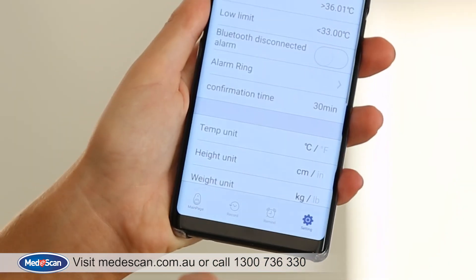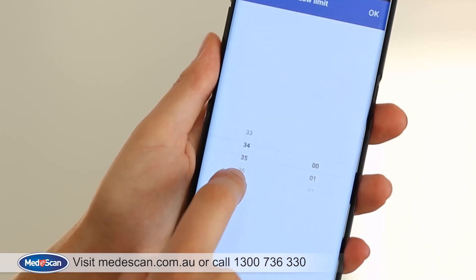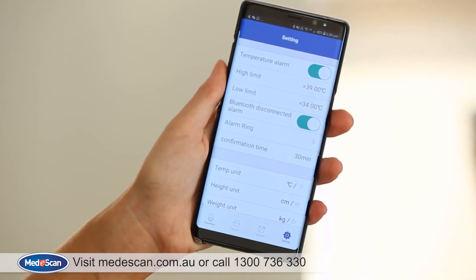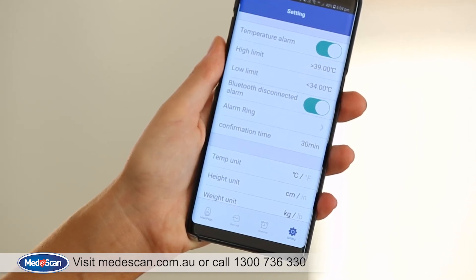On the settings tab, you can adjust the high and low range of temperatures and the app will notify you if the patient's temperature rises or drops outside the selected range. You can also adjust other settings like the unit of temperature from Celsius to Fahrenheit, weight from pound to kilograms and height from inches to centimetres.